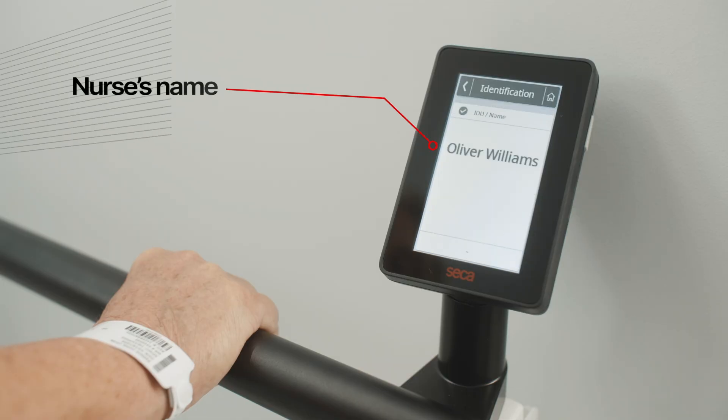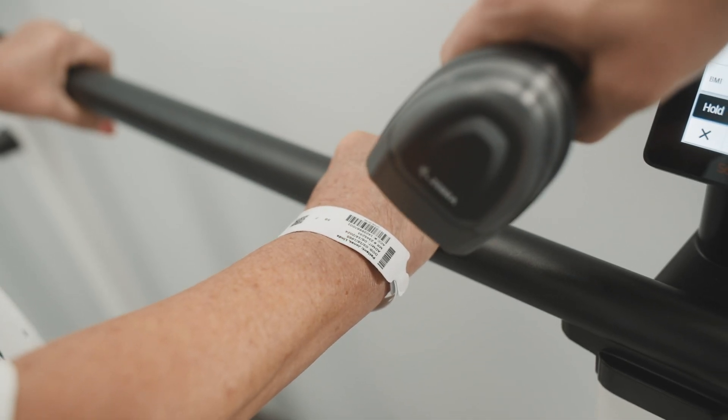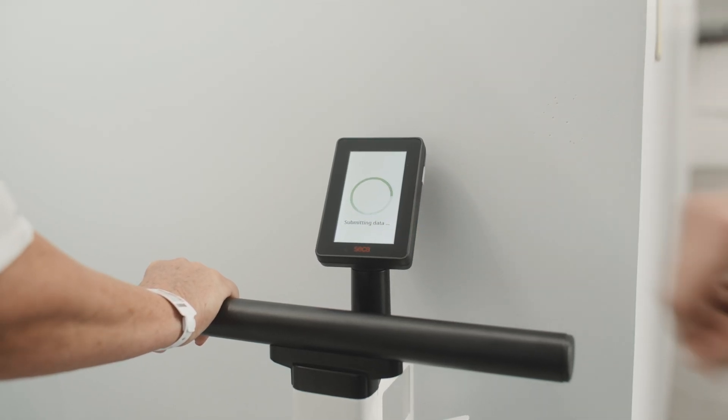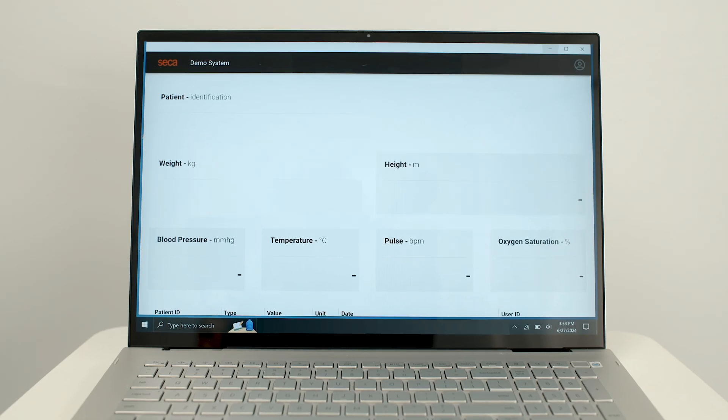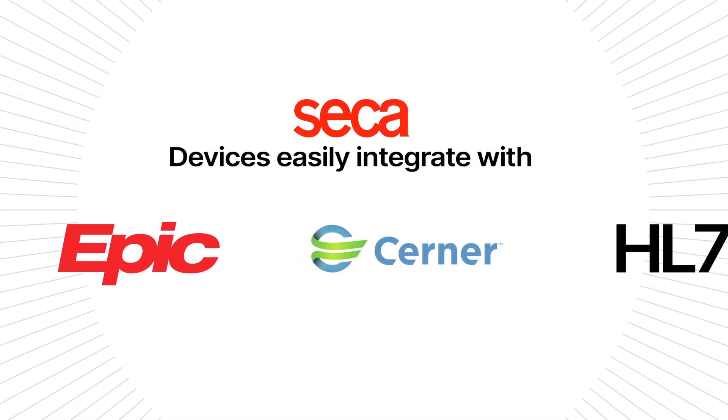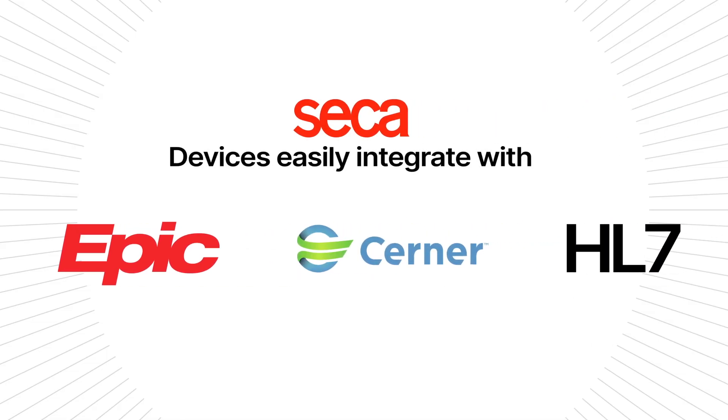All you need to do is scan your ID, then the patient's ID. As soon as you press send, the results will immediately appear in the patient's chart. As the only scale manufacturer with validated and direct EMR integration capabilities, Sika Solution provides peace of mind for everyone.